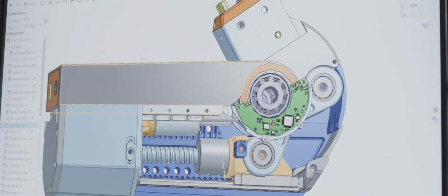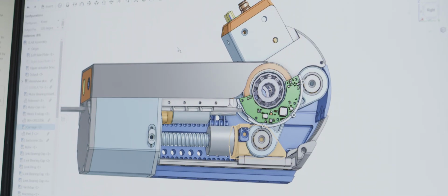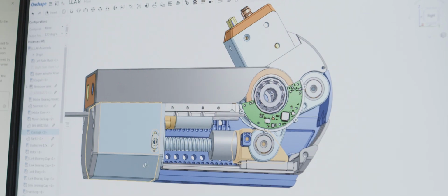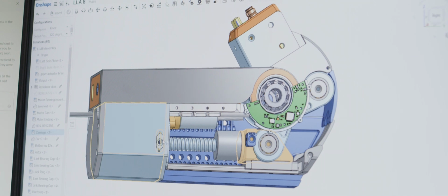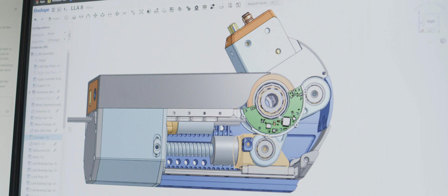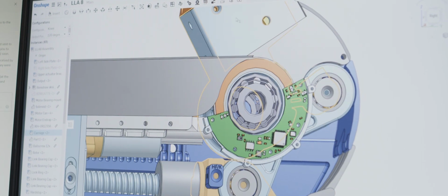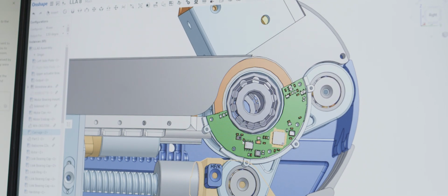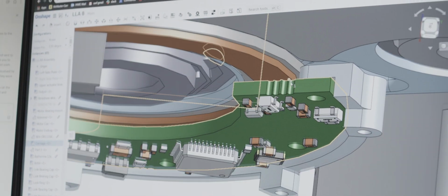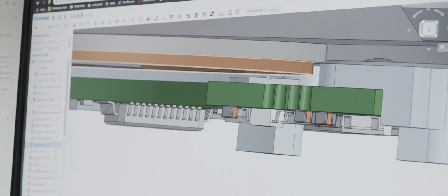So this is the actuator that powers the joints in our exoskeleton. It is powered by an electric motor and driven by a ball screw transmission with a linkage system. On the output, we have a magnetic encoder here provided by RLS. It is a non-interference magnetic encoder.